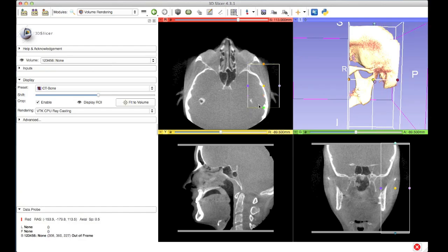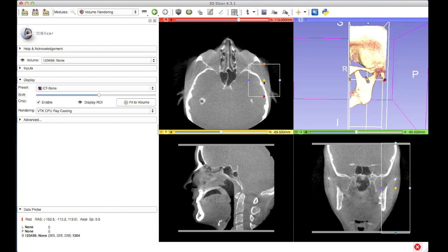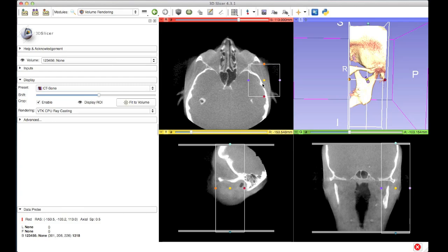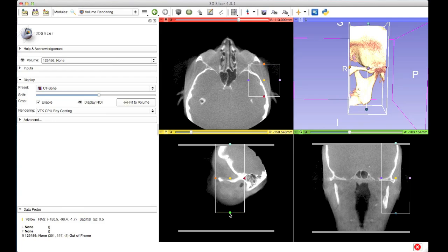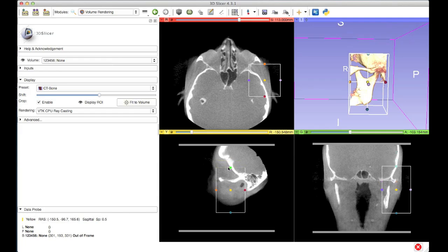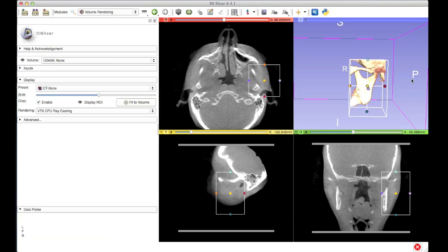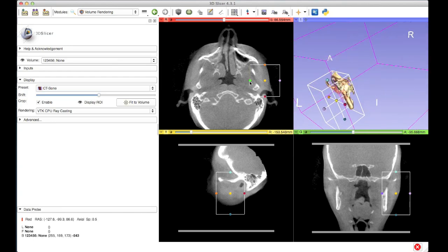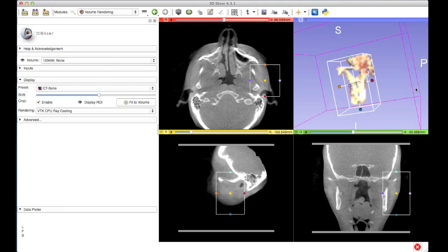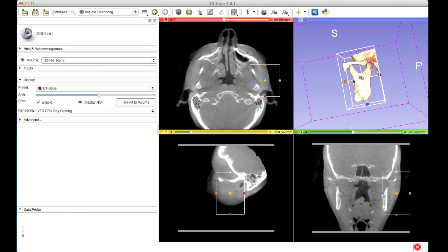This really helps me inform which part of the volume I'm picking during my crop. So I'm going to go ahead and limit this down to the TMJ, and I'm going to use the shift hover to reveal this slice in the other sagittal and coronal views. I'll continue shrinking this ROI until it contains only the region I'm really interested in. On the superior side I'll crop out most of the temporal bone, so that ultimately my 3D printed model really centers on the TMJ. You can really see here how my volume rendering is helping guide the region selection.